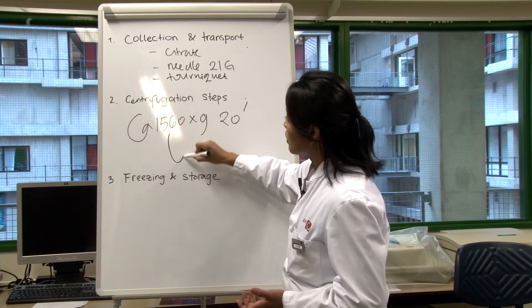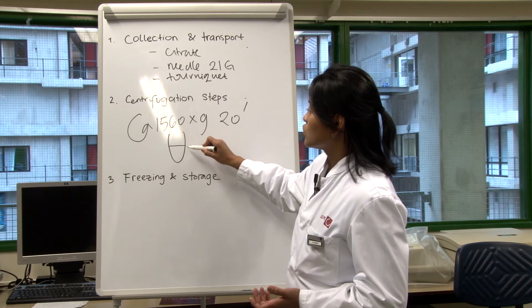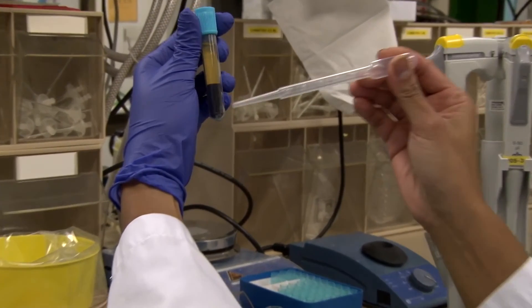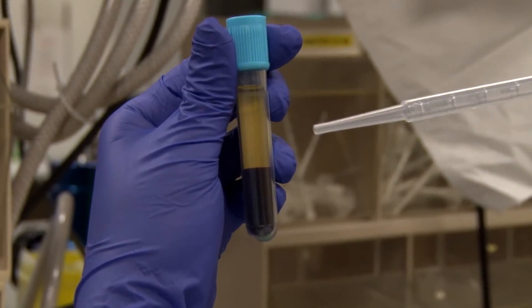When we finish with the centrifugation step, the blood will already be separated into several phases. The lower part contains the red blood cells, here you have the buffy coat, and the upper part — this is your plasma.